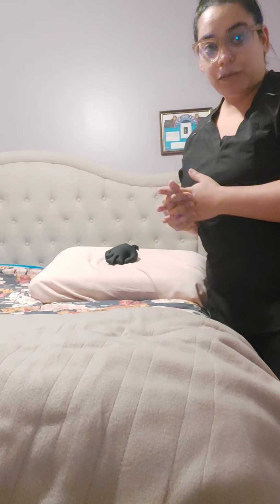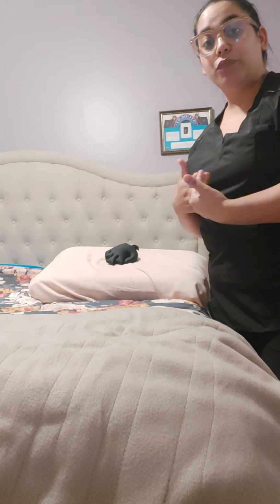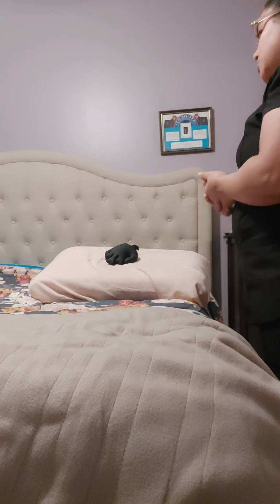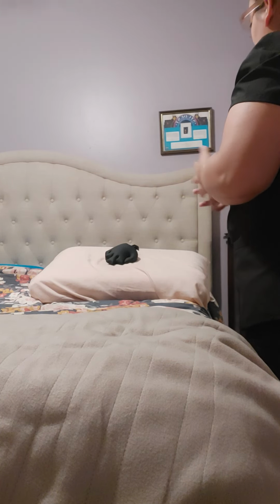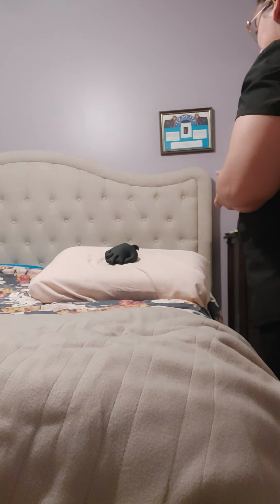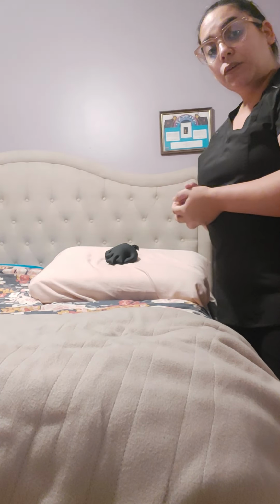Once I have identified my patient, I will explain to the patient what I am here for and what the assistant is here for. So Ms. Gonzalez, I'm here today to do a procedure called the insertion of an indwelling catheter. Your provider has ordered this, and if it's okay with you, I'm going to go ahead and insert the catheter that he spoke to you about earlier today. Is that okay? Yes? Okay, great. Once you have gotten permission from the patient, you can continue.